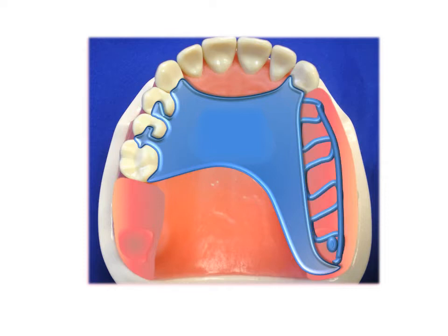Time to consider clasping. Our surveying determined that the molar has 0.01 inch undercut on the disto buccal, perfect for a cast half round direct retainer. We have known that the patient was aesthetic conscious, but could not afford an attachment on number 11. We have two options. One option is to place an abbreviated cast circumferential clasp on the distal half of the tooth.